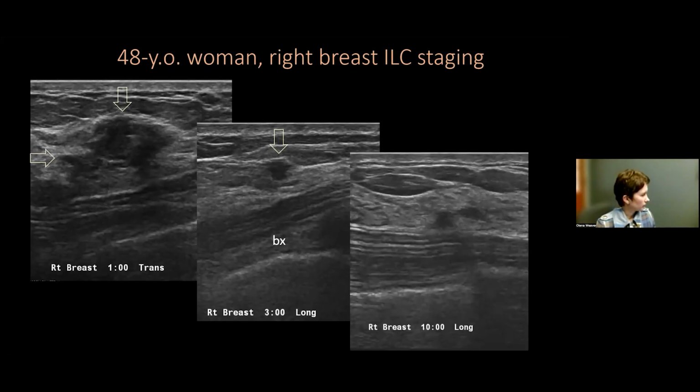biopsy this one. And going actually towards the lateral aspect of the breast around 10 o'clock, we saw these little masses. And without knowing that there is something enhancing, it might be probably easier to dismiss it as a fibrocystic change, but we did know that there is something enhancing, so we do have to take it seriously, and we decided to biopsy this also with ultrasound guidance.